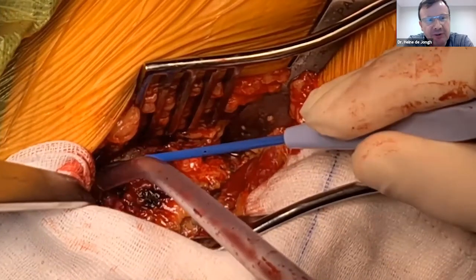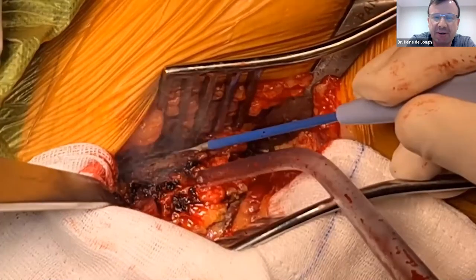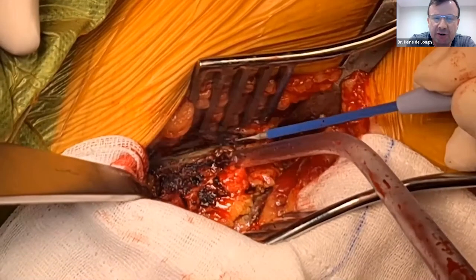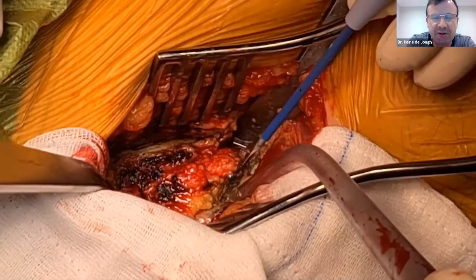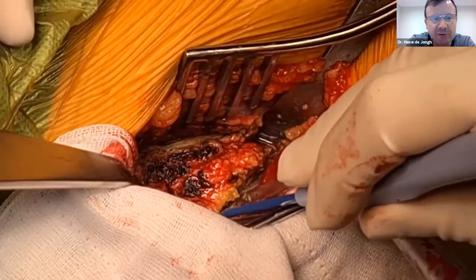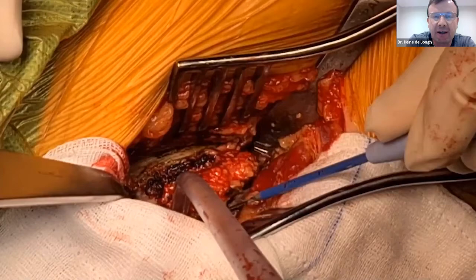The capsulotomy, I hope you can see the video. The capsulotomy, I do a little bit differently. I do a lateral capsulotomy. I find my iliocapsularis, and then here I follow the crista, and then I open it up on the lateral side with my 2 Homans extra-articular at the moment.